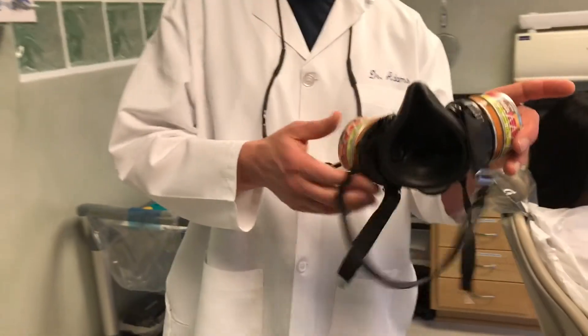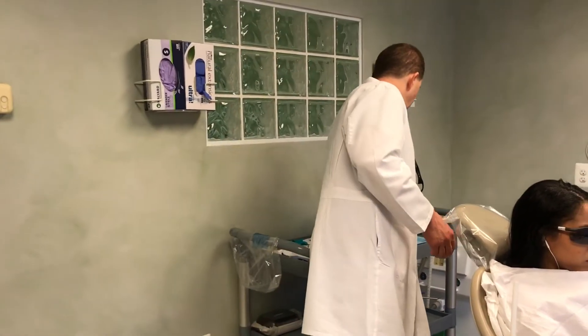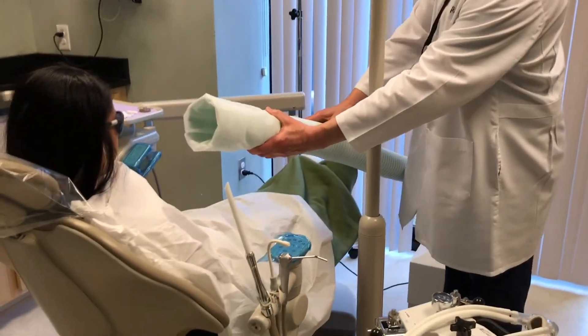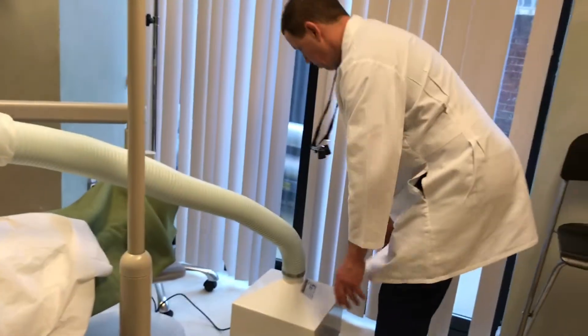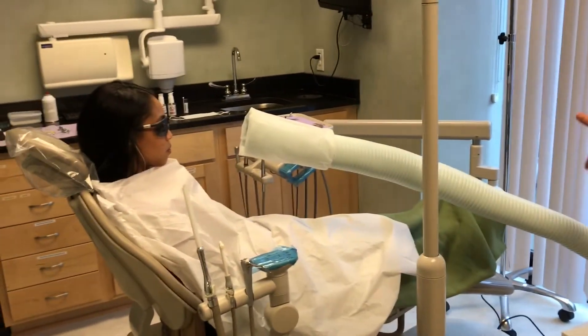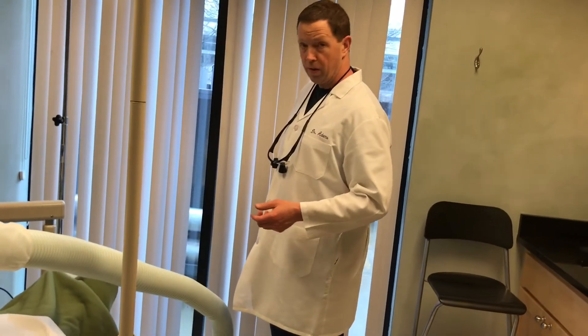We protect ourselves — the doctor and the assistant — with these masks. We put these on so we can breathe and it decreases the potential that we might inhale any mercury vapors. We're also really concerned about contaminating our office, so we have this vent here. The vent gets placed very close to the work area and draws air — kind of like a kitchen vent when you're cooking bacon. The mercury vapor goes through here and there's a special filter that filters out the mercury. We do not want our office contaminated with mercury.